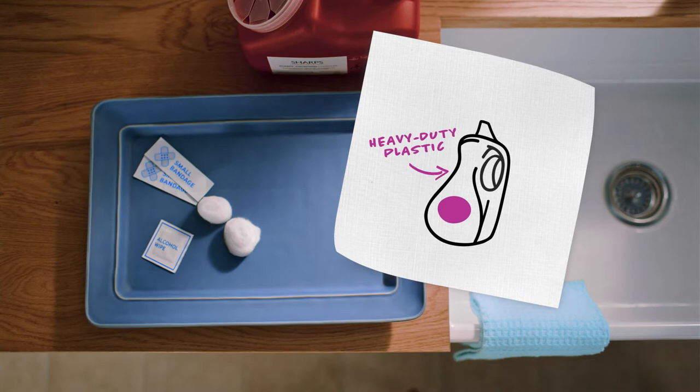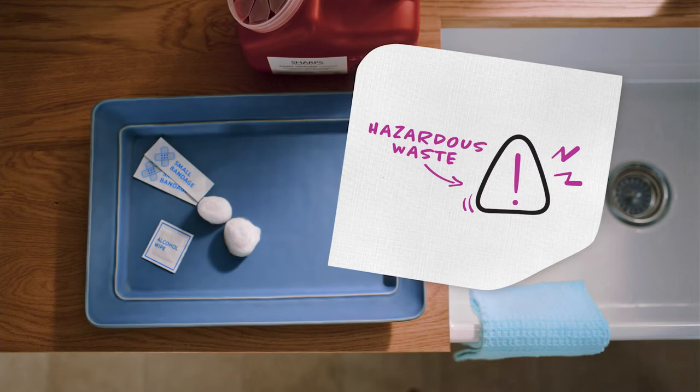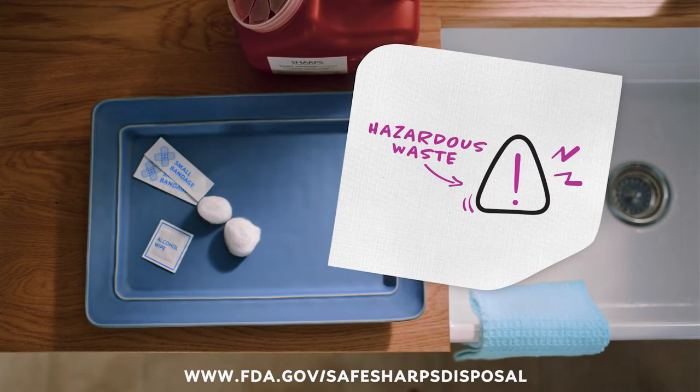The container should be made of heavy-duty plastic, be able to close with a tight-fitting, puncture-resistant lid, and be leak-resistant. Label the container so you and anyone else that comes across it knows it has hazardous waste inside. When your container is almost full, follow your local guidelines on how to dispose of your sharps container. You can call your healthcare professional or visit the FDA website for more information.